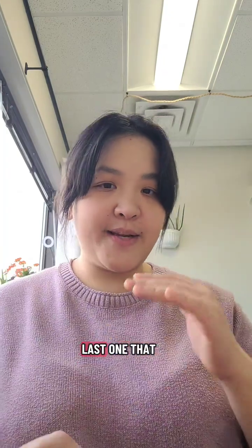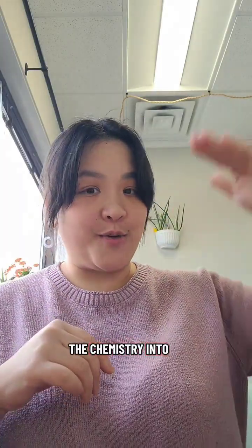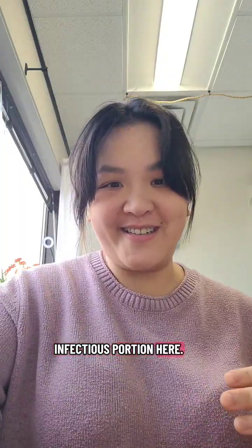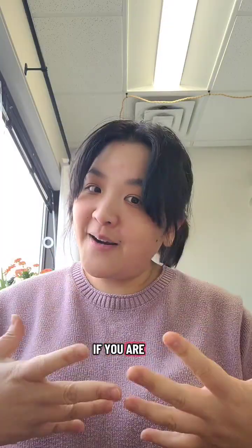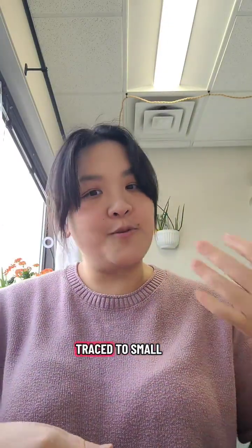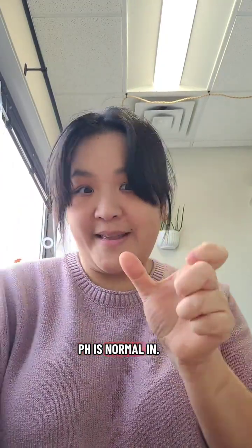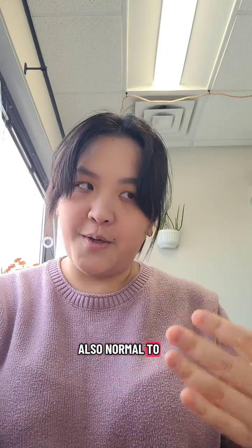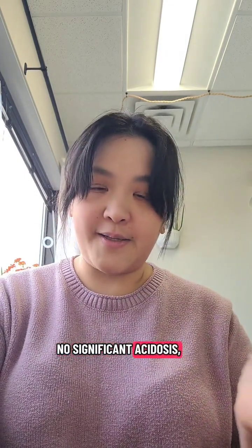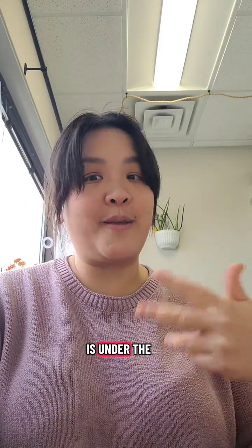I think the last one that I'm going to talk about here is going to be the ketones, because this neatly divides the chemistry into the metabolic portion and more of the infectious portion here. So with ketones, if you have a normal diet and you're eating carbs, this should be negative. If you are on a ketogenic diet, this could be trace to small with normal glucose and without acidosis, which means the pH is in the normal range. If the ketones are moderate and there's also normal to low glucose and no significant acidosis, again, the pH is in normal range, then sometimes this can mean that this person is under the effects of starvation.